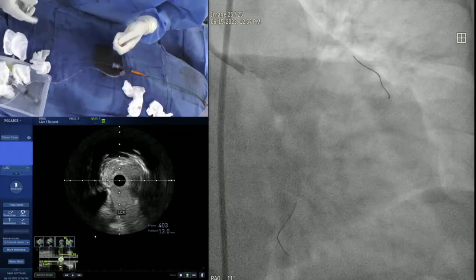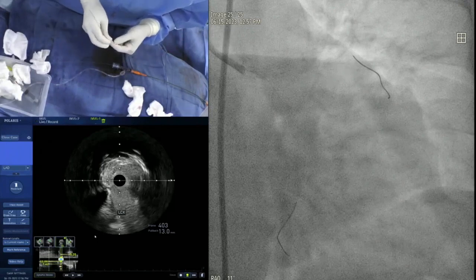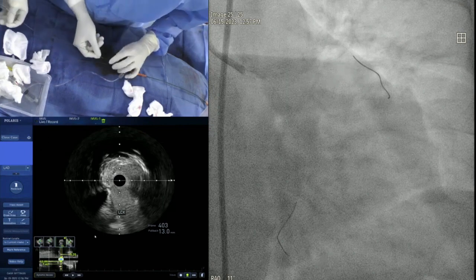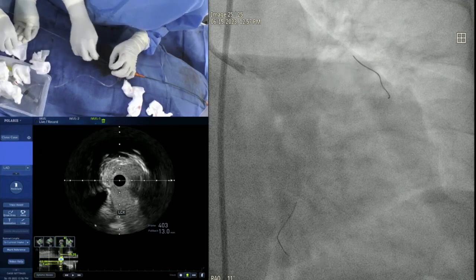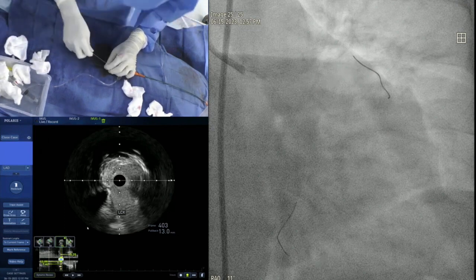Will you do a little bit of touch up of the ostial circ or not? No recross and kiss. Actually, myself and Greg published that from the EXCEL trial. Greg, do you want to discuss that paper? Kiss versus no kiss after left main stenting?